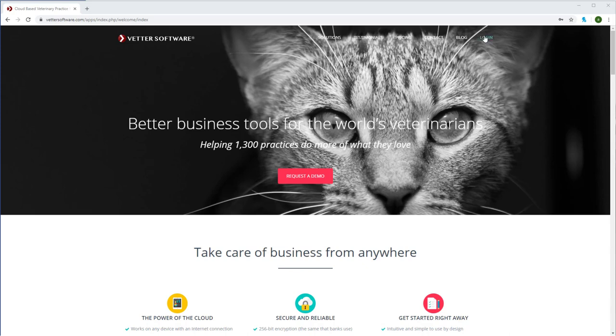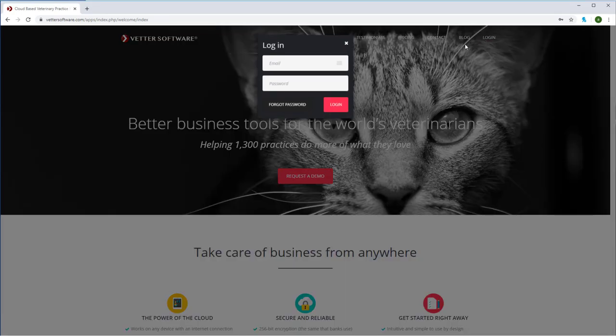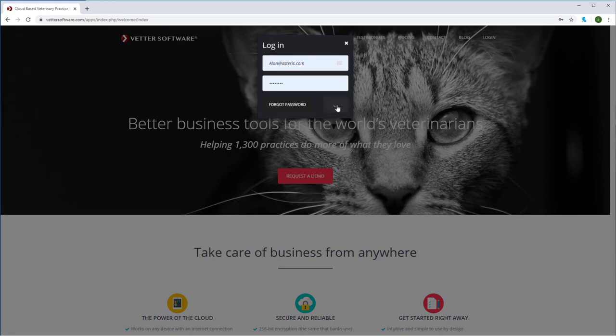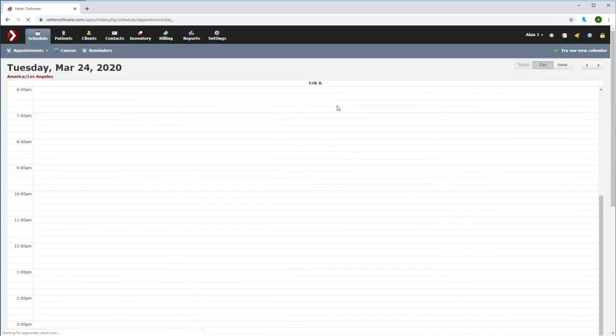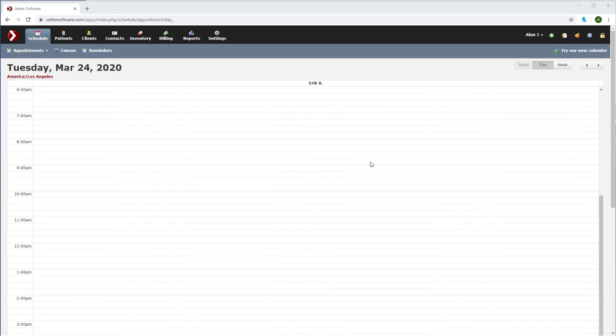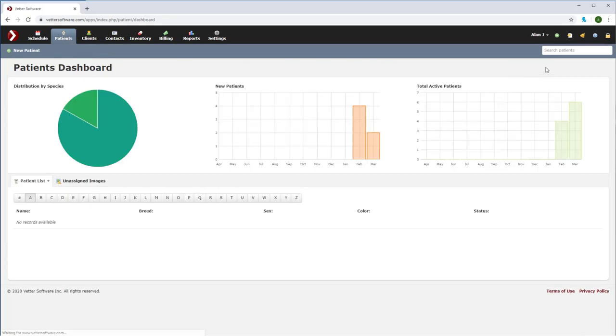Start by logging into your Vetter account. Now that we're logged in, search for the patient that requires imaging. Go to the patient tab, and then we can search for Cookie who I'll be using as my test case today.